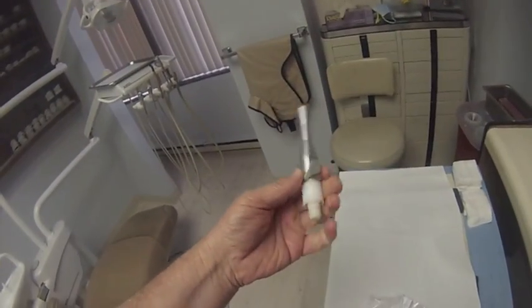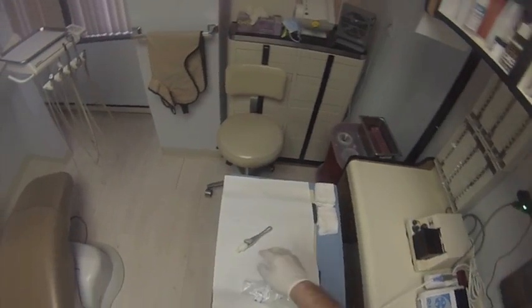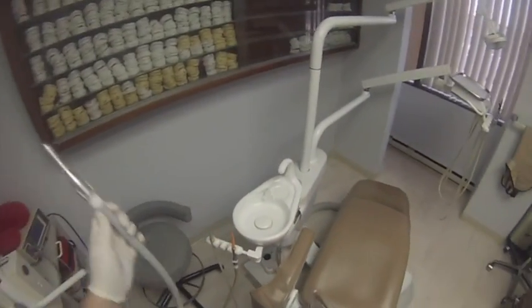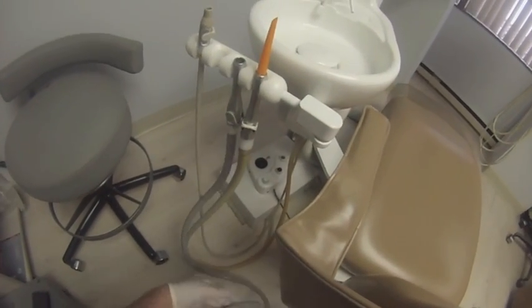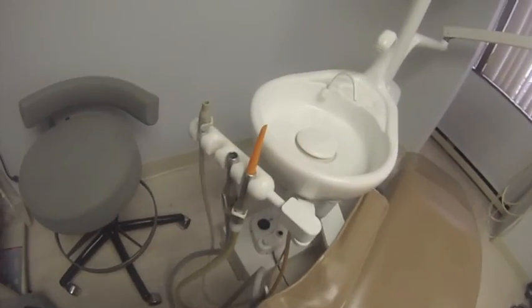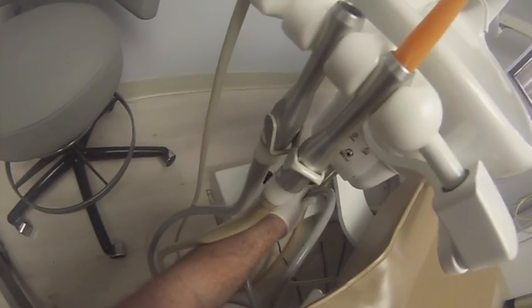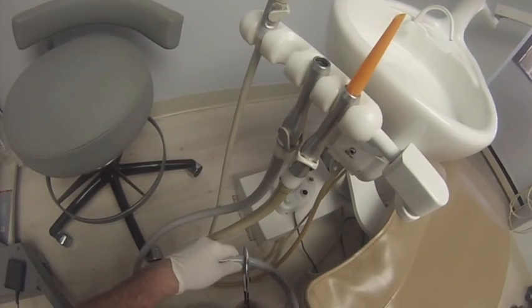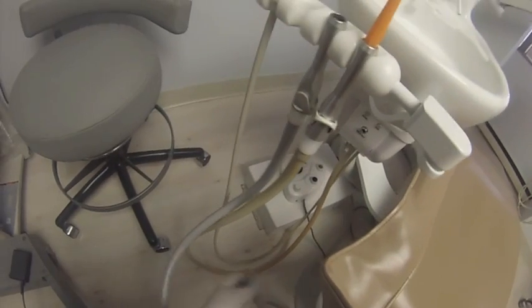The final decision you'll have to make is the type of valve you want to install. I just happen to have this type of valve as a spare in my office, so I'm going to install that. The first step is to press it into the existing hose. Then I'll measure the amount of hose I need, place it on my rack, use the existing hose to duplicate the length, figure out where I want to splice it in, and cut it right in the middle so I've got enough length to reach the patient.